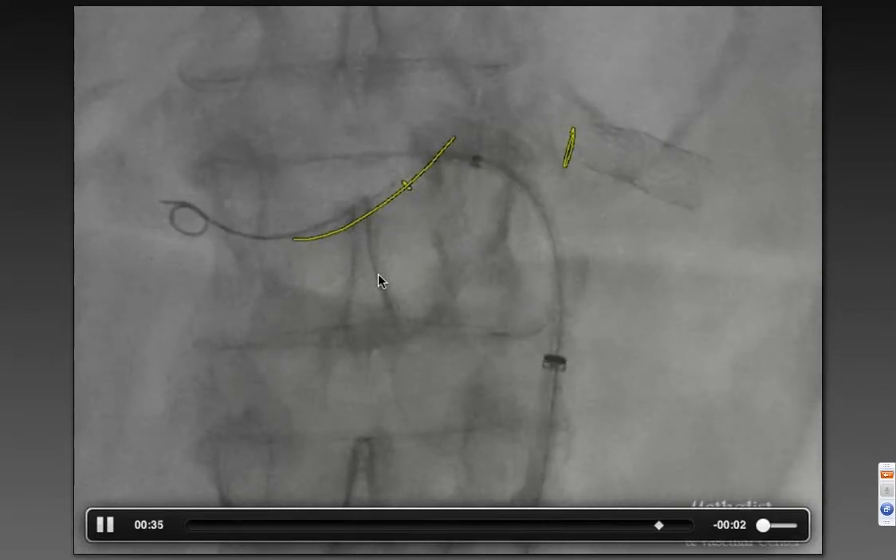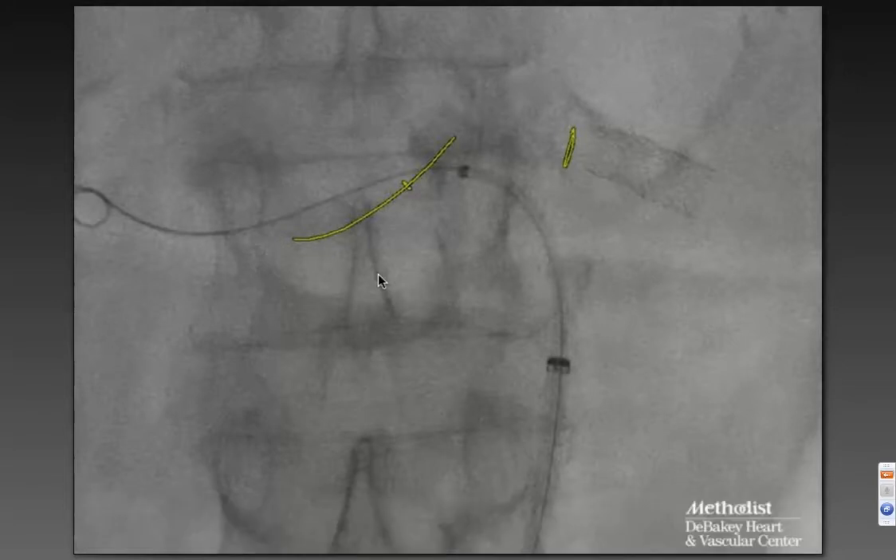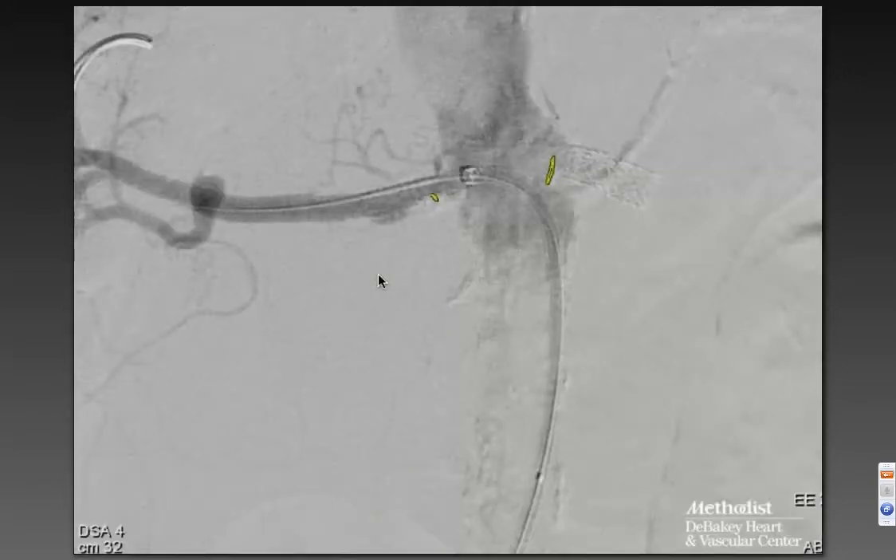We closed our eyes, advanced the wire, and that allowed us to go ahead and bring the sheath up into position. We took the leader out, went ahead and angioplasted it, and then came in right after that with a stent.